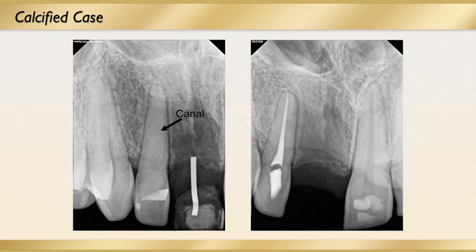Here's a couple cases I wanted to show from my office. This is a trauma case. This is a 20-year-old kid, and I did a consult on him. He came back 2 weeks later, and I have to be honest, I was not looking forward to him coming back. I did not want to treat this case because I knew it was calcified. The canal appeared mid-root, and this is extremely deep, and I knew this would be very difficult.